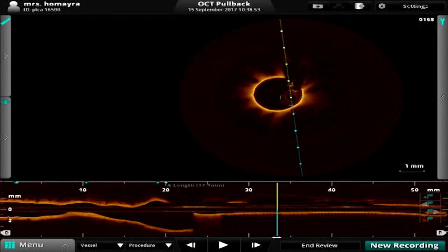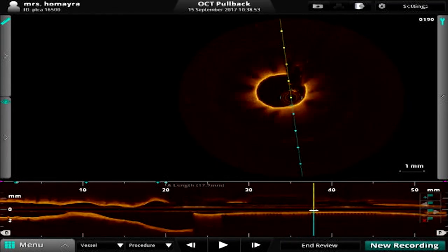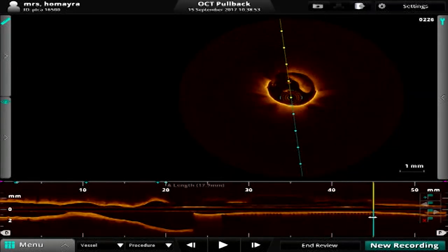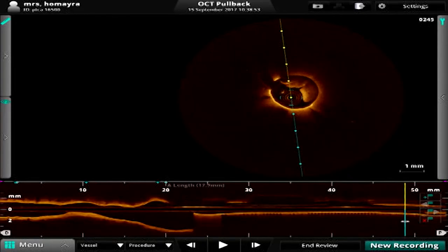From one side, we know that any stent, especially a biodegradable scaffold, may cause some problems in small vessels. But on the other hand, it might be tempting to prove the concept of using BRS in small vessels because they dissolve and potentially nothing will be left there.